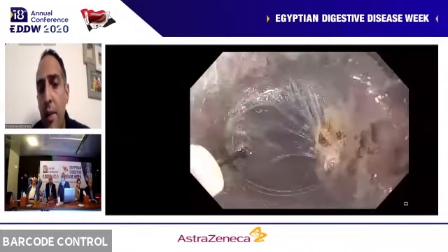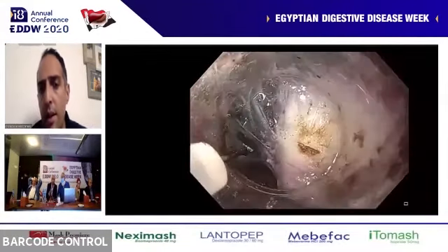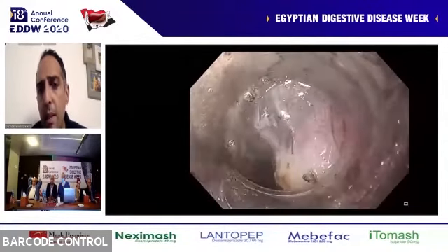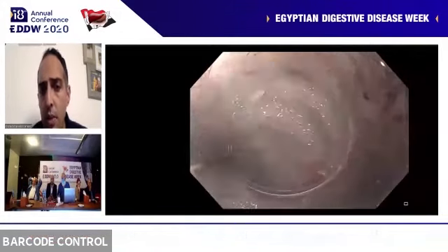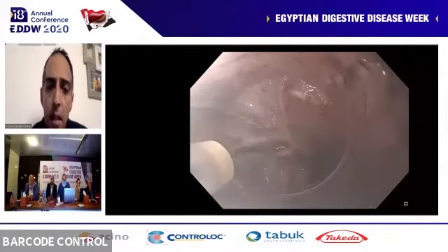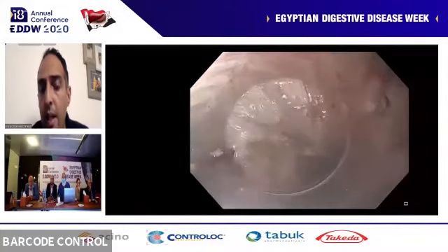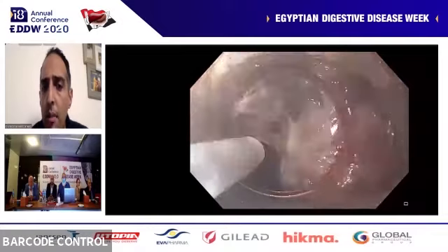There are different classifications of the depth of the tumor in the muscularis propria. In this case, it is a little bit superficial. That's why we didn't perforate the muscle layer completely. We didn't reach the adventitia, but sometimes you have to make a complete cut of the muscle layer, and with this you are making an intentional perforation. But as I said, it shouldn't be a big problem as long as the mucosa is intact.